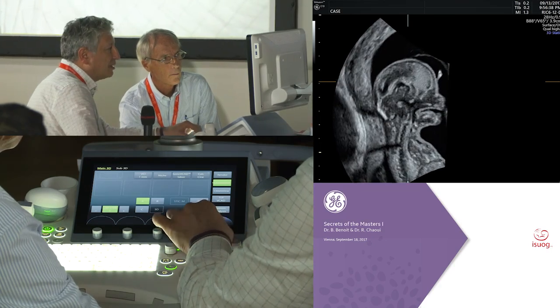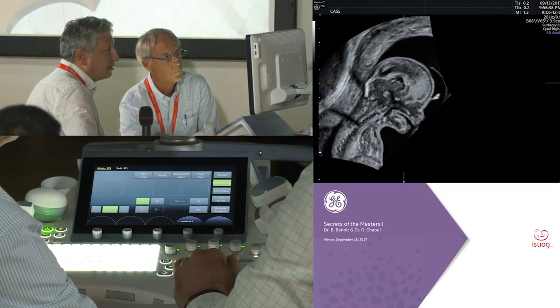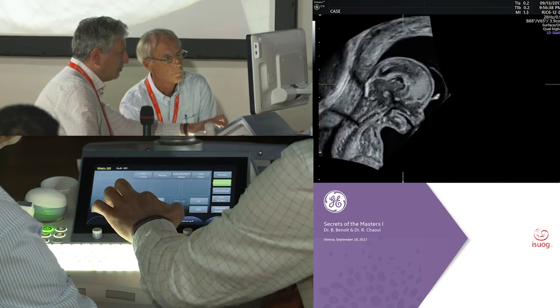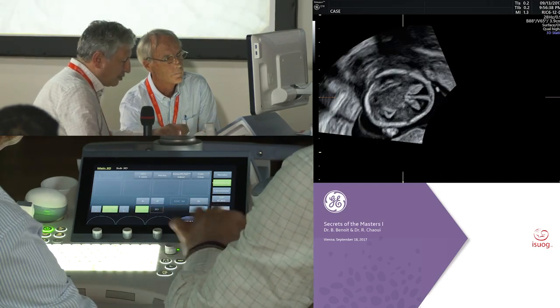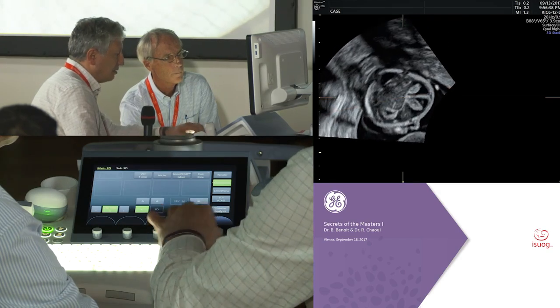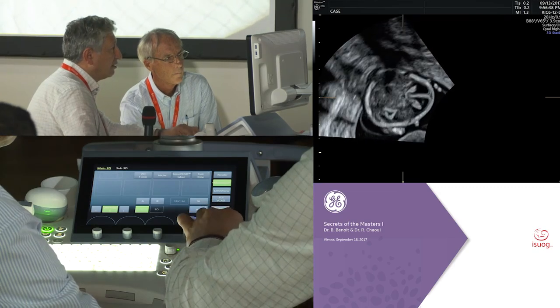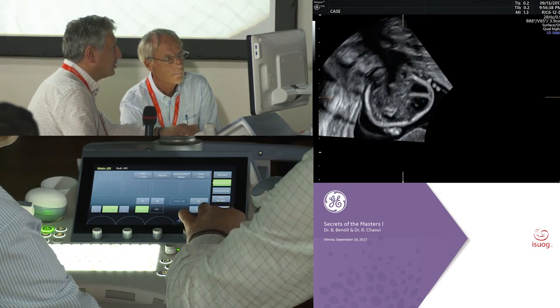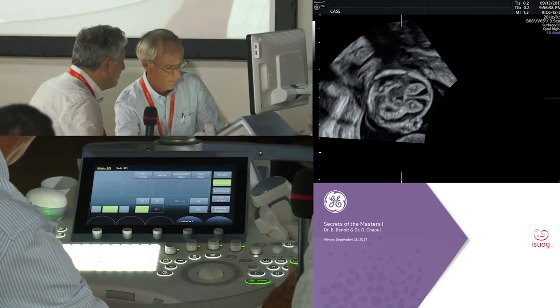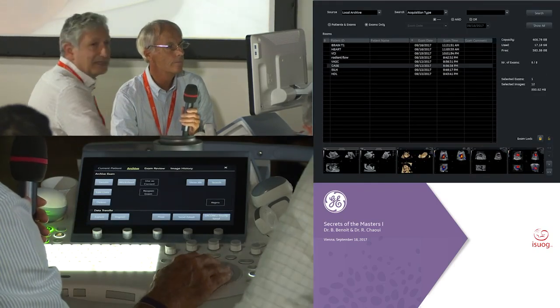So actually, I would like also to see the same in an axial view. You can scroll here and you see that all is shifted to the posterior part of the brain. But actually people are more interested in, let's go to something more fun, like the face. The face? Yes, the face.